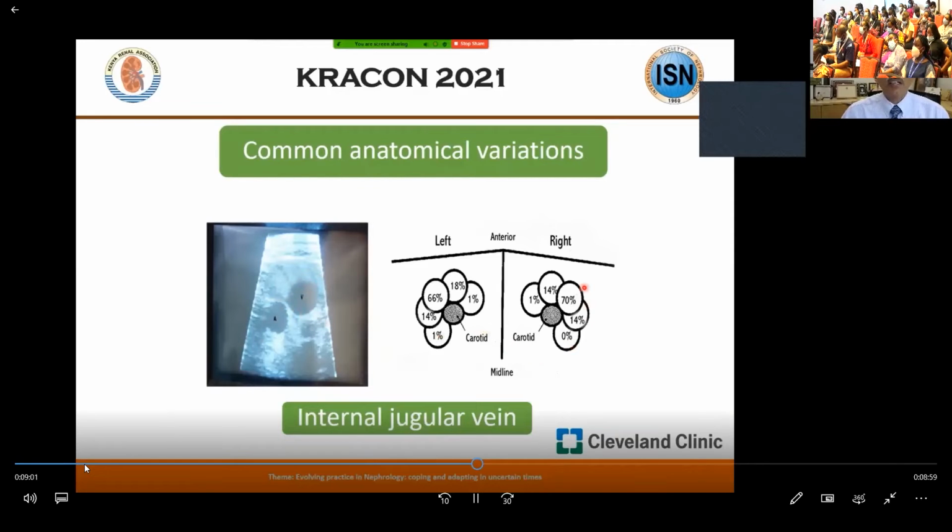And if you look here, the most common association between the jugular vein and the carotid artery is superolateral, but oftentimes we do see the jugular vein right above the carotid, or even rarely right below or medial to the carotid. So hence, a blind procedure certainly can lead to more inadvertent puncture of the carotid artery or hematoma formation. With ultrasound, we can identify and select the path to enter into the vein alone.